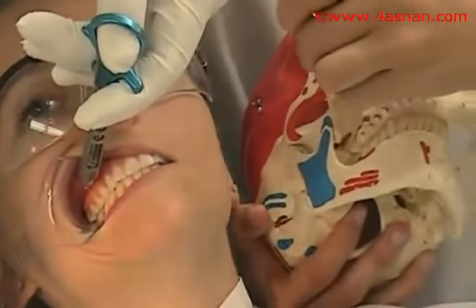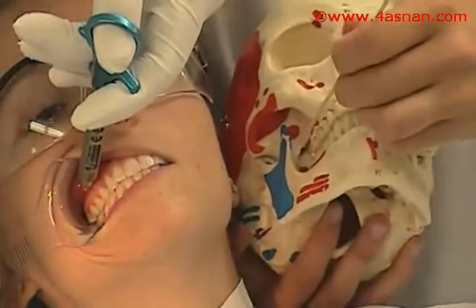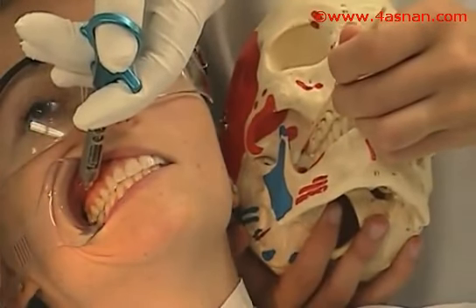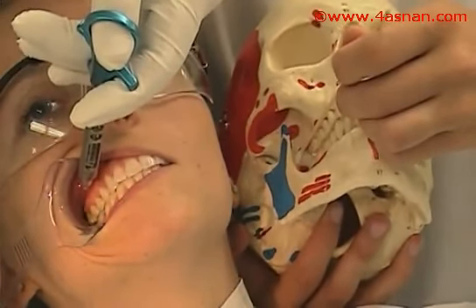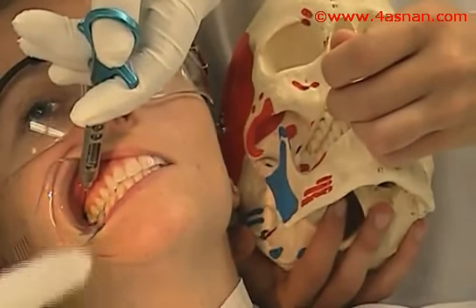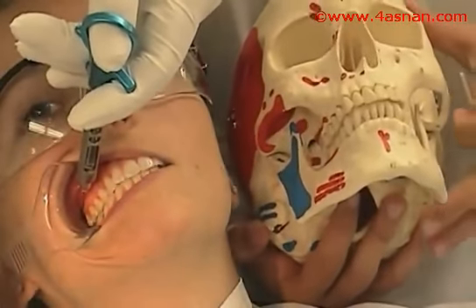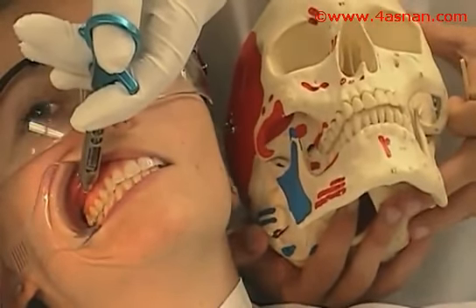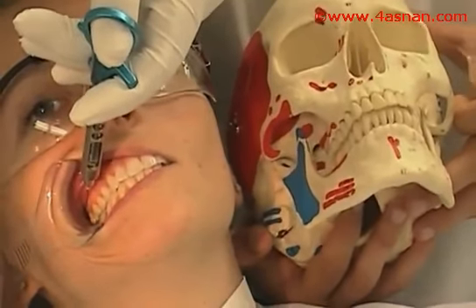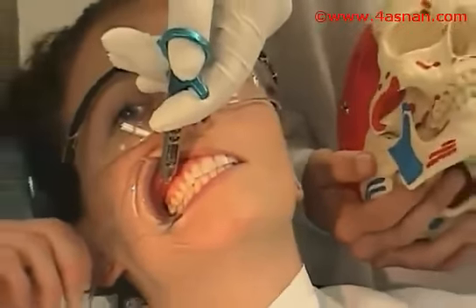Orientation of the bevel: the bevel must be orientated away from the bone of the mandibular ramus. Place your left index finger or thumb on the coronoid notch, reflecting the tissues of the medial aspect of the ramus laterally. Reflecting the soft tissues aids in visualization of the injection site and decreases trauma during needle insertion.